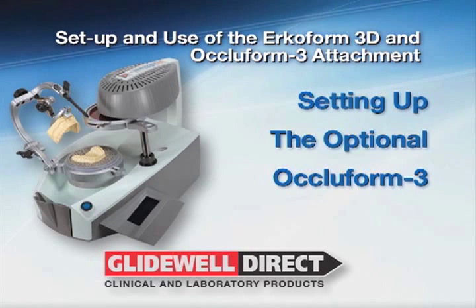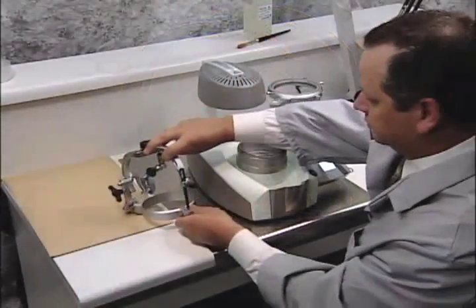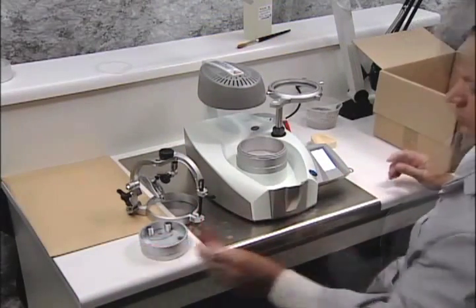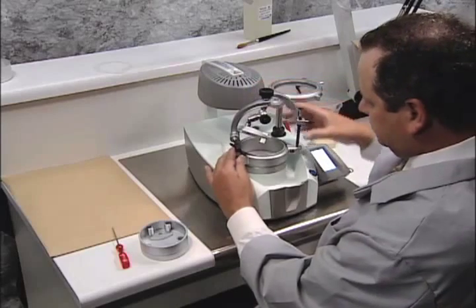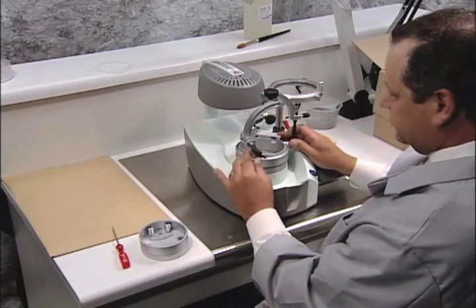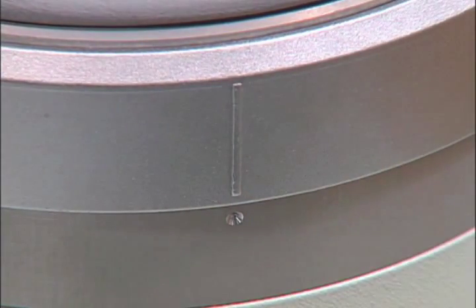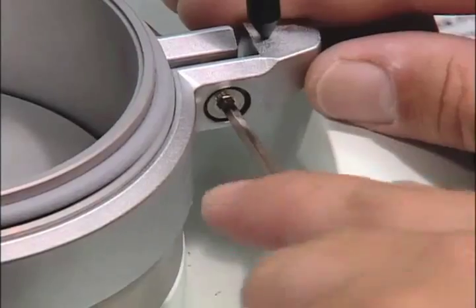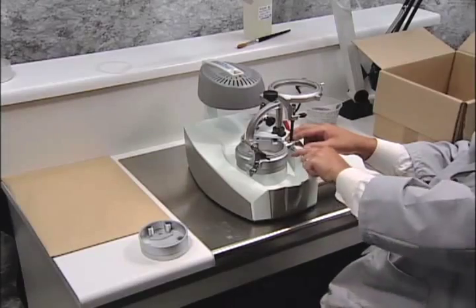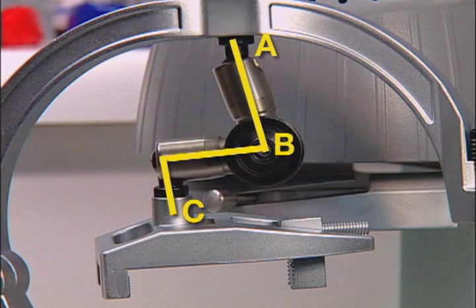Now let's set up the optional Ocloform 3 device. Remove all parts from the box and lay them out. Place the fixation ring onto the Erkoform 3D housing and line up the pin with the supporting pin at right angles to the unit. Make sure to align the point at the form pot of the 3D housing unit with the ring. Be sure the fixation ring is seated firmly and tighten the Allen screw. When positioning the arresting joint, align points A, B, and C as shown.